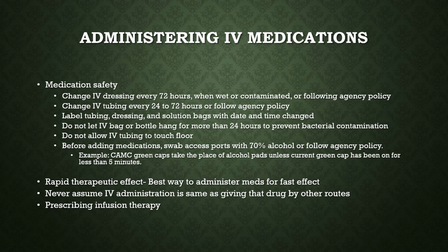Otherwise, you kind of have to go back through your nurse's notes and try to find out when that IV was started. So if it says it right over the IV site, that's extremely helpful. We want to be careful not to let IV bags touch the floor, and tubing.